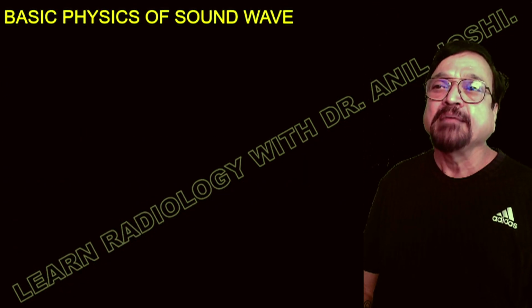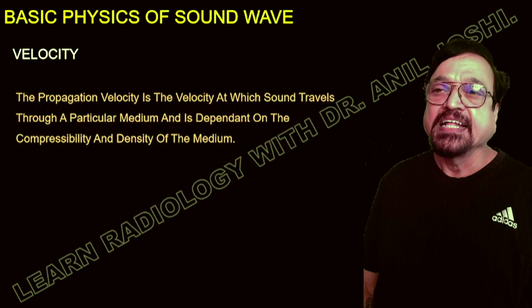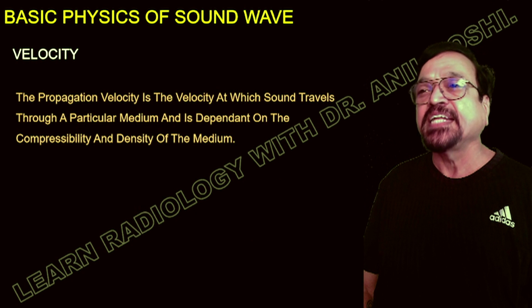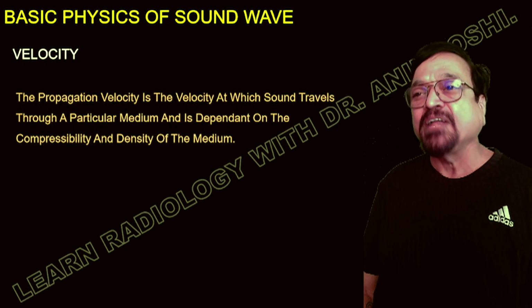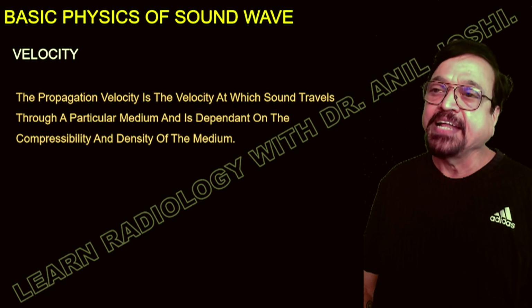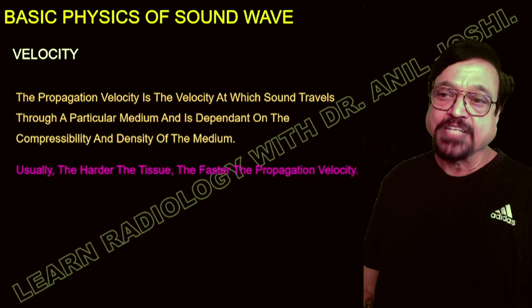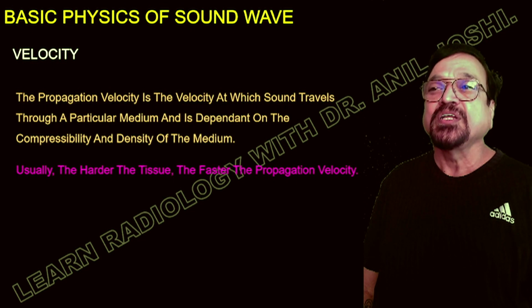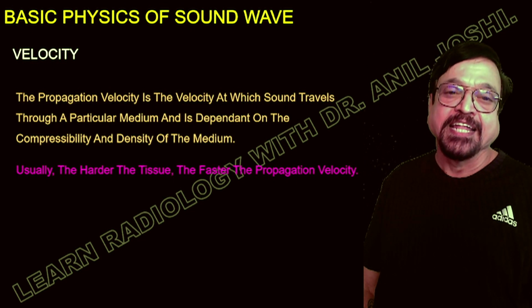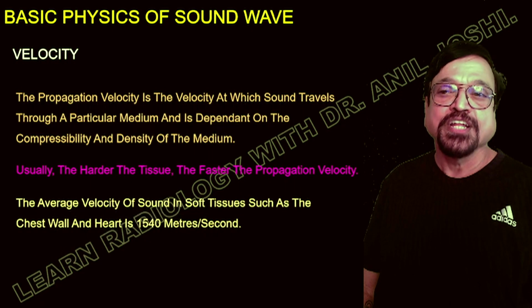Now what is the basic physics? Now coming to the velocity. What is the velocity? The propagation velocity is the velocity at which a sound wave travels through a particular medium and is dependent on the compressibility and density of the medium. So these are the two things which we must know. Usually, the harder the tissues, the faster will be the propagation. So it will be more in the bones as compared to the soft tissues.